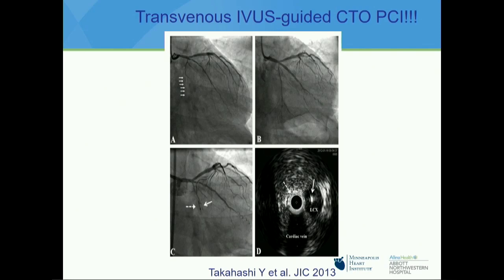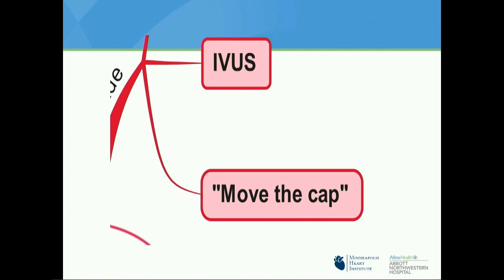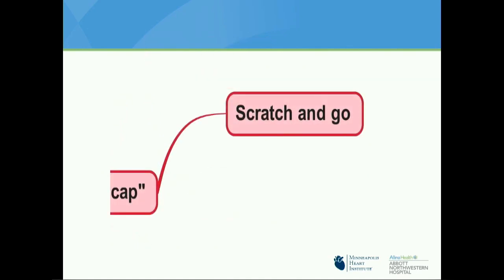There have been reports of even transvenous IVUS-guided CTO PCI, really only useful for the circumflex. I have not done this, but just for completeness, that was shown. The more important things to understand and to be able to do are the techniques of moving the cap. And there are a couple of these.